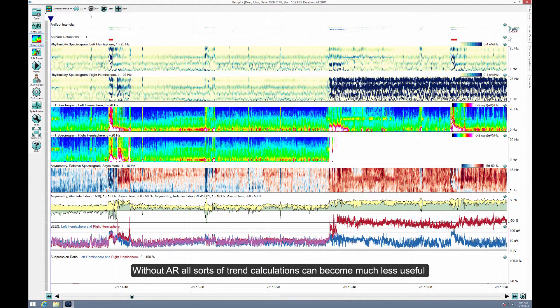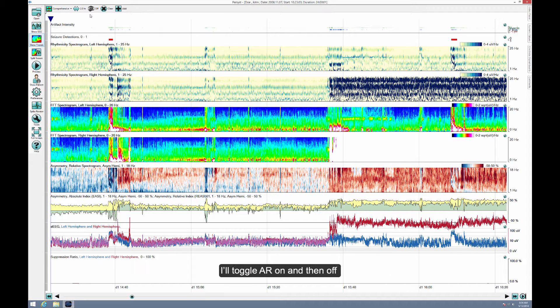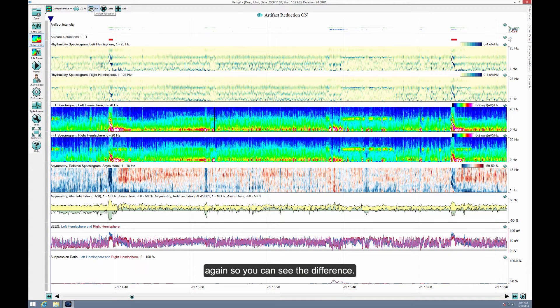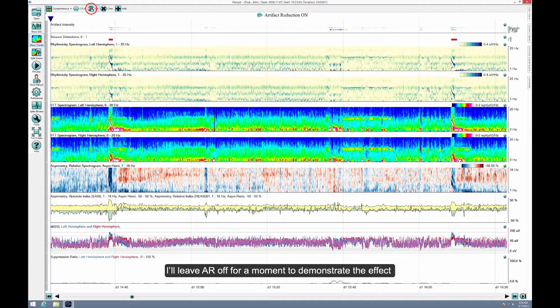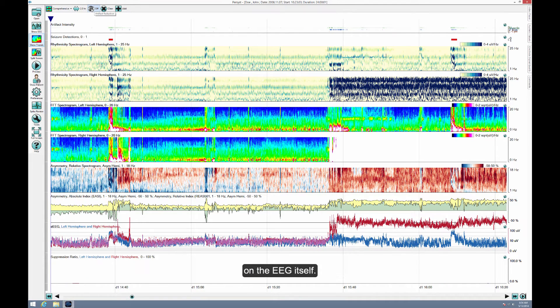Without AR, all sorts of trend calculations can become much less useful, since the artifact is admixed with the cerebral signals. I'll toggle AR on and then off again so you can see the difference. I'll leave AR off for a moment to demonstrate the effect on the EEG itself.